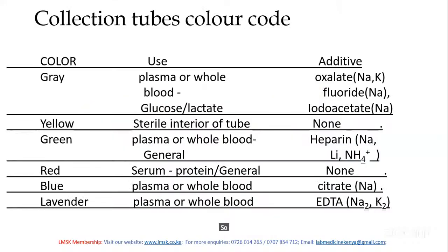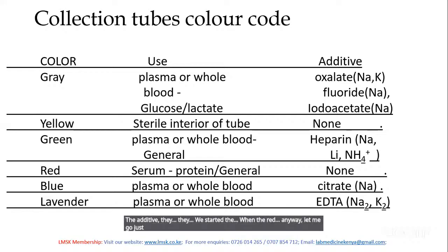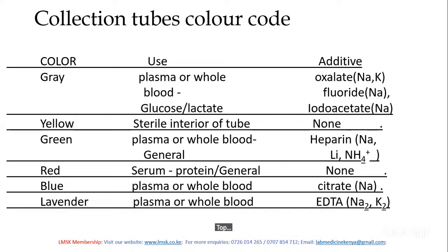So just a brief of what color code and the additive. We started with the red. Anyway, let me go just the way it is. Gray color top. The additive found there is sodium oxalate or potassium oxalate. That is an anticoagulant.